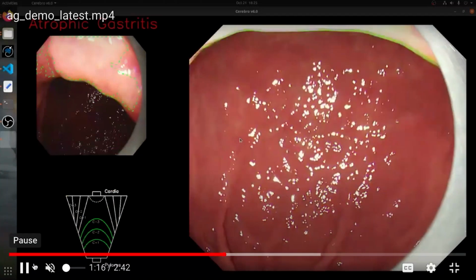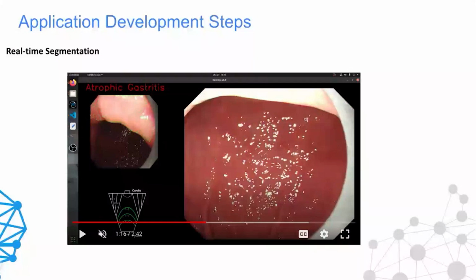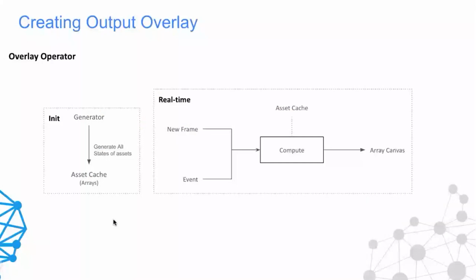I just want to pause here and tell you that most applications may just require you to put a box in real time or maybe a segmentation mask. But our requirement was putting these diagrams and some complex objects on the screen. We realized that it is also time consuming. So not just pre-processing, inferencing, and post-processing, but also the overlay creation needs to be given its due share of optimizations. The way we do it, we have a separate operator for overlay. During initialization of this operator, there is a generator that generates all the states of all the objects that we saw on the screen.